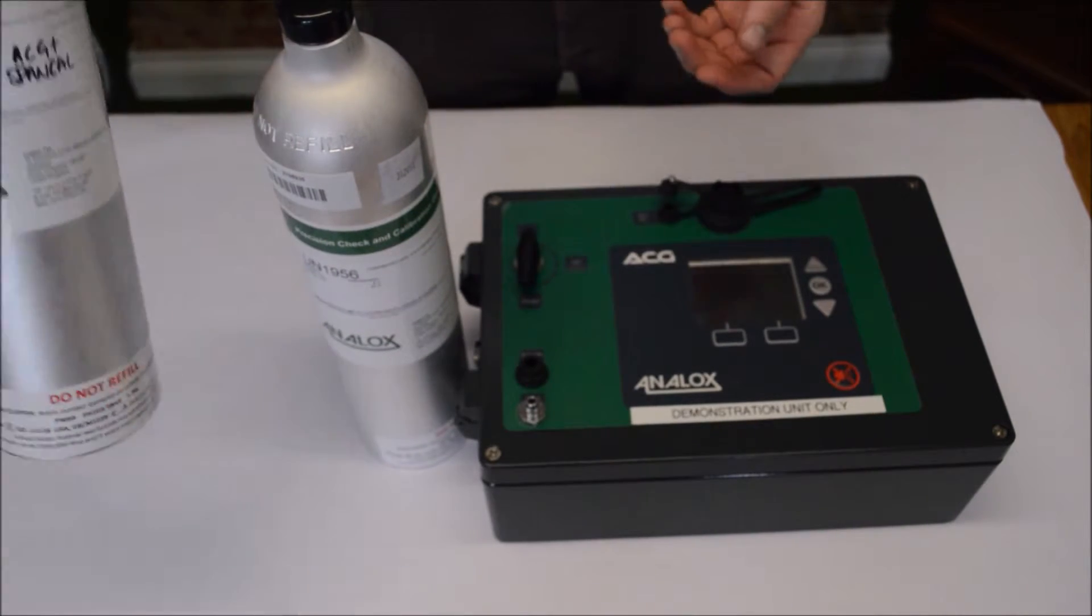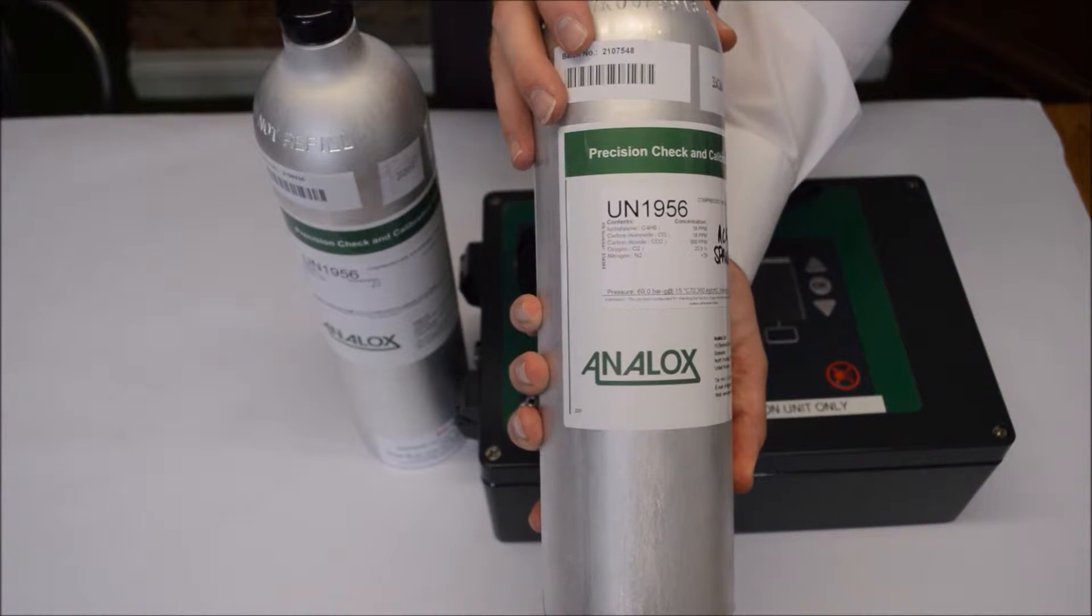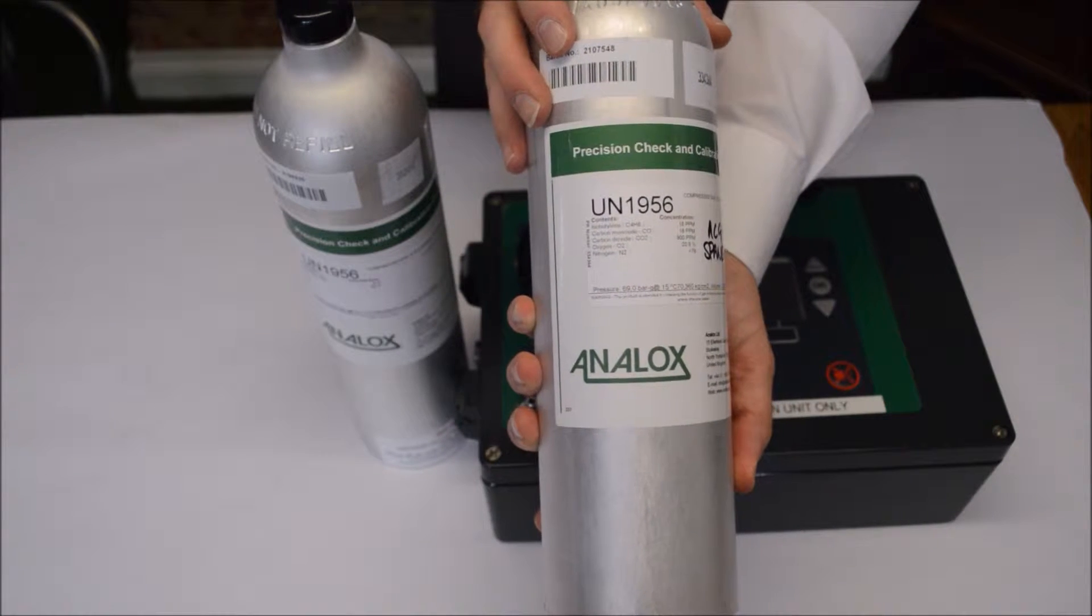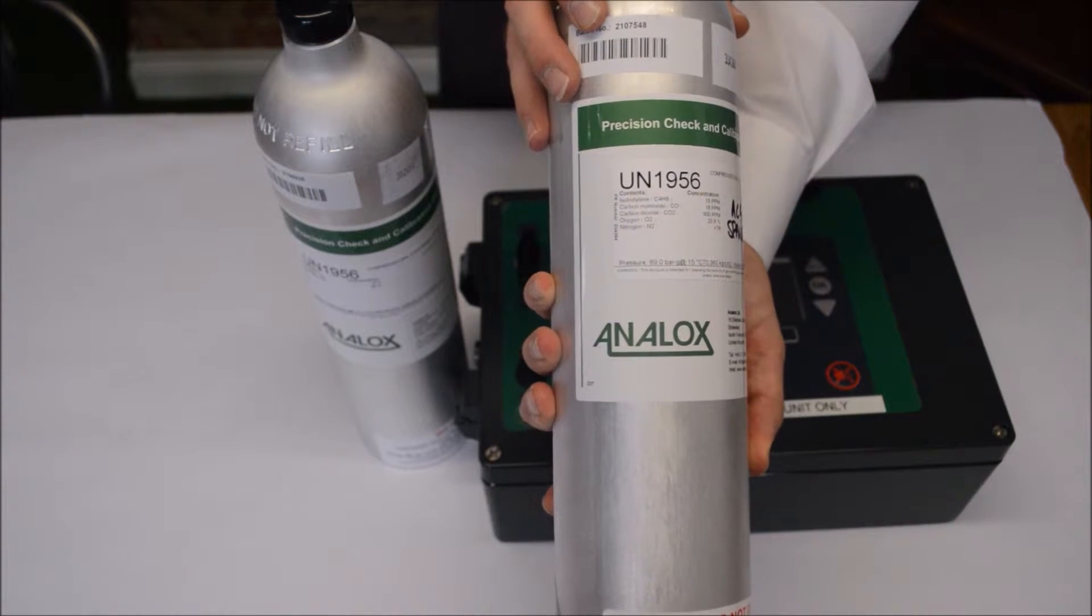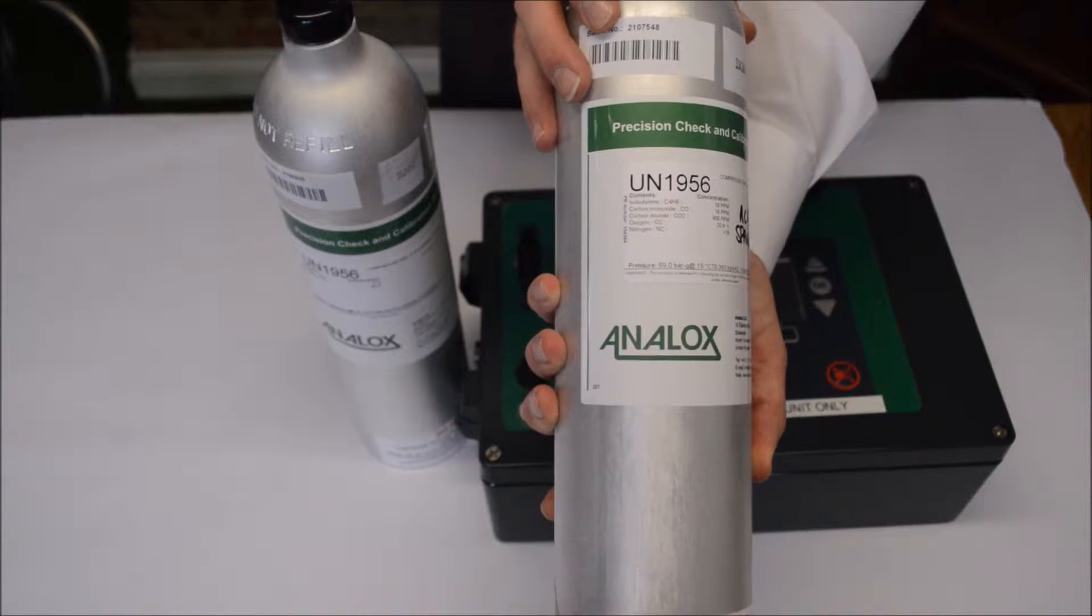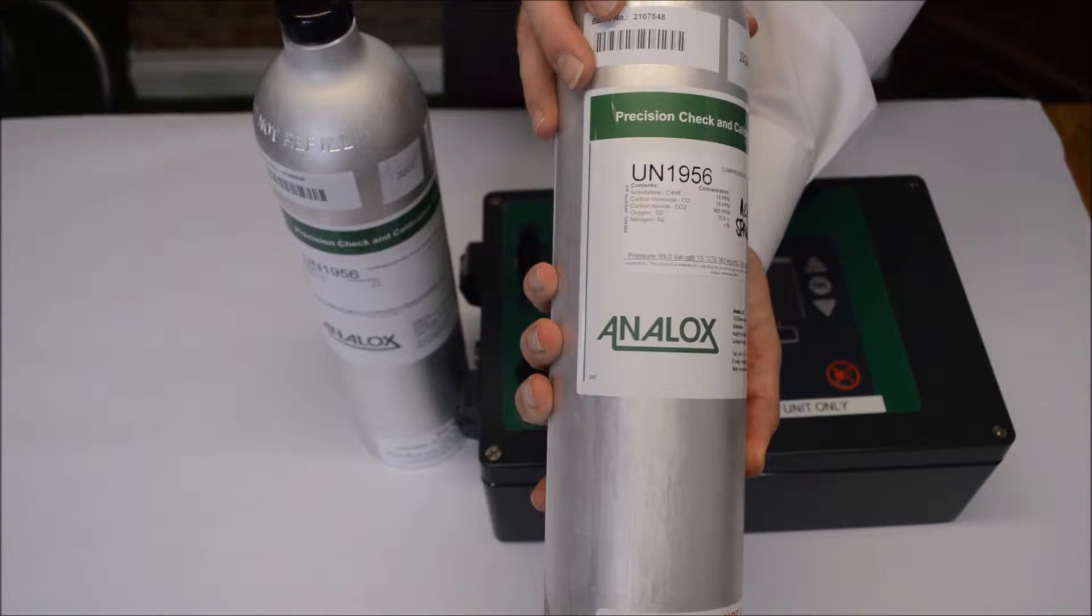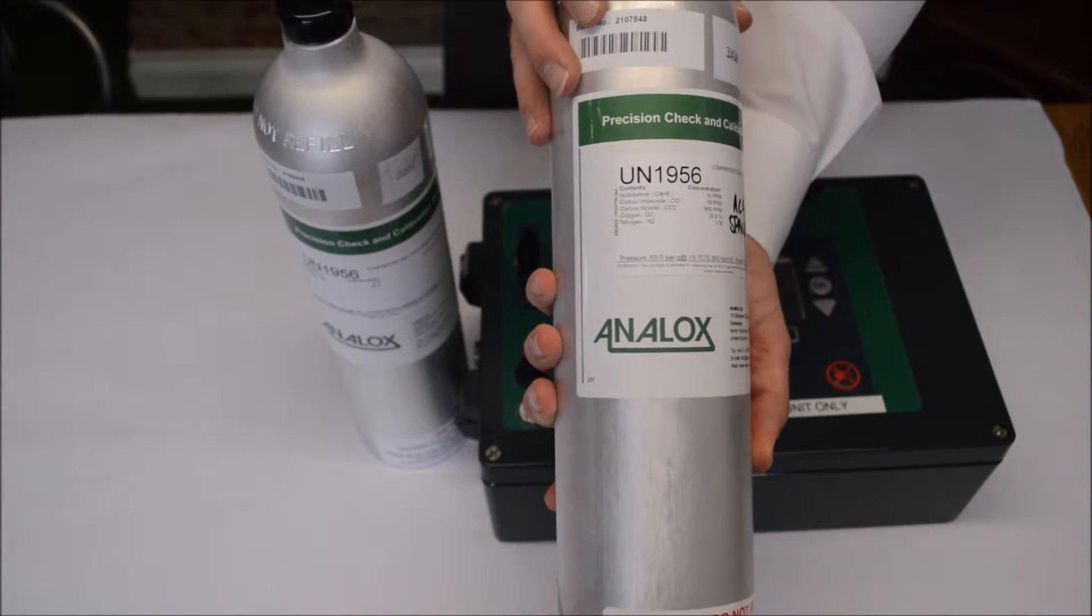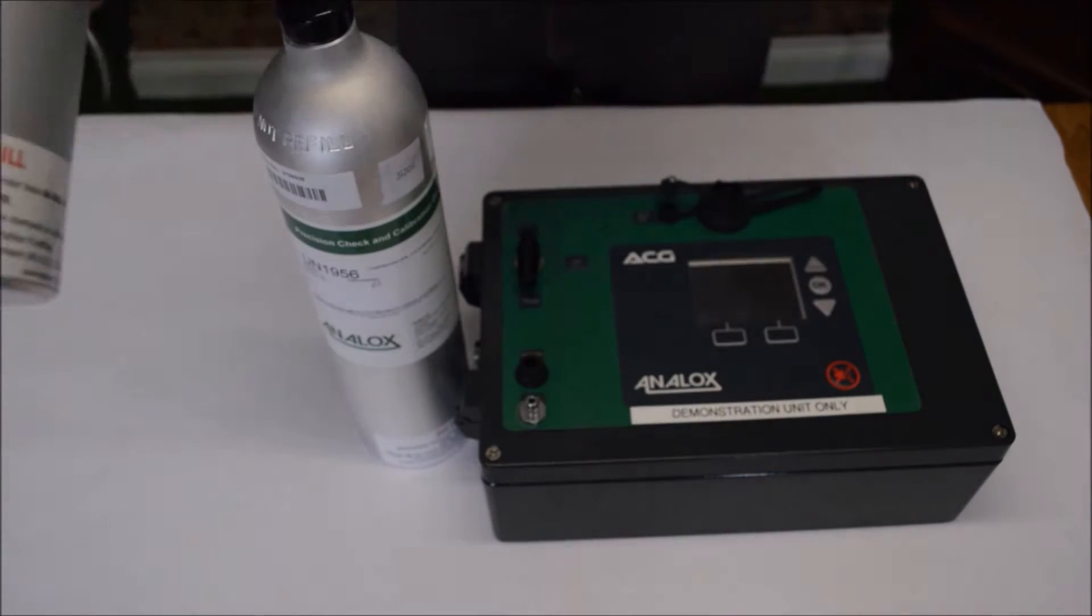Our span gas for the span calibration is this one, which is 18 ppm isobutylene, 18 ppm carbon monoxide, 900 ppm carbon dioxide, 20.9% oxygen and 79% nitrogen. That's the gas mixes that you require.